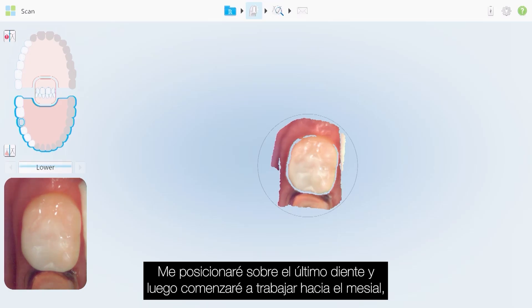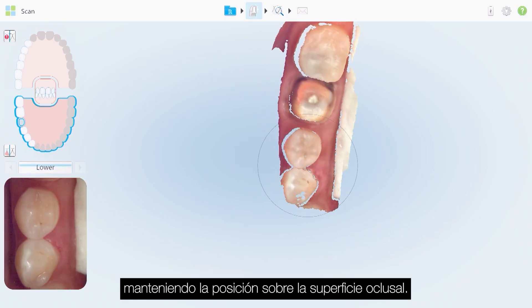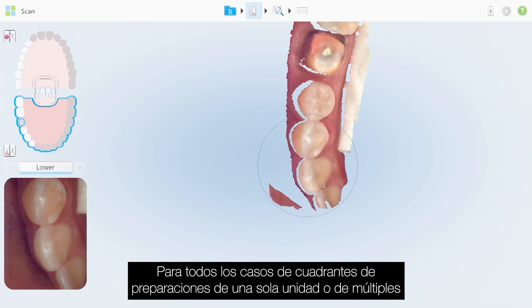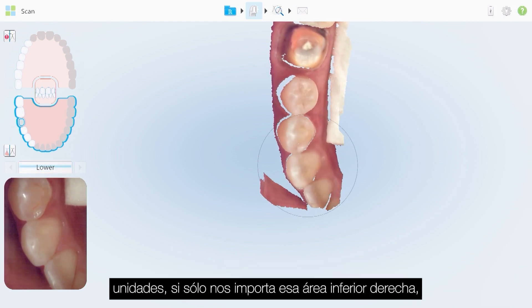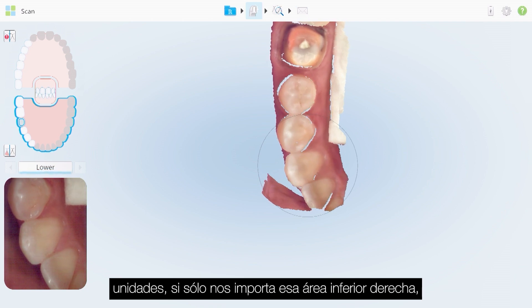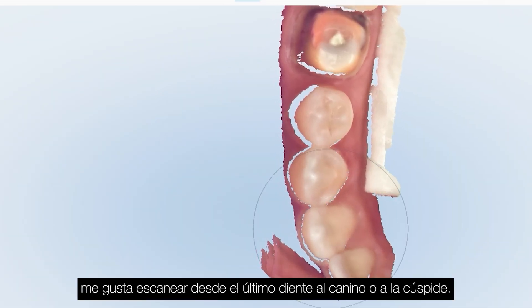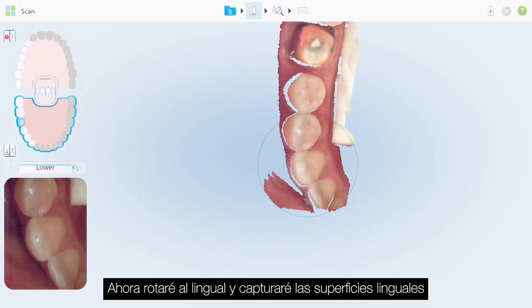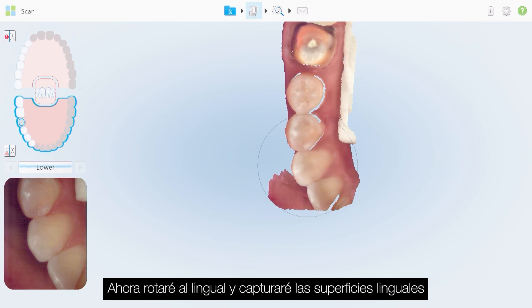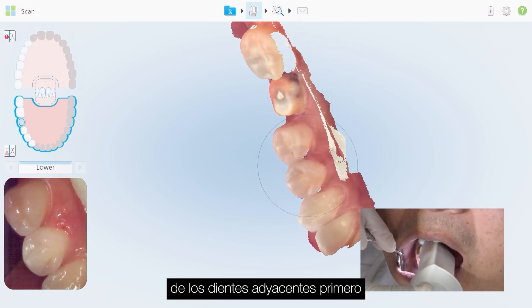Now we'll move on to our quadrant scans. I'll position over the last tooth and then work my way toward the mesial, maintaining a position over the occlusal. For all quadrant situations — single unit or multiple unit prep — if we're concerned with the lower right area, I like to scan from the last tooth to at least the cuspid or canine. Once I reach the canine, tooth number 27, I'll rotate to the lingual.